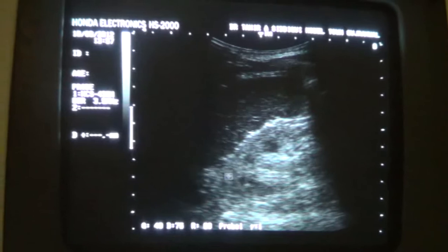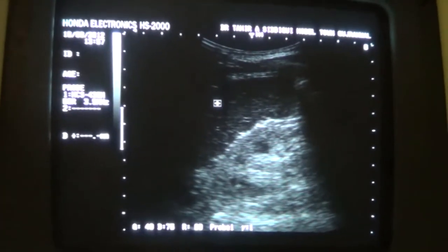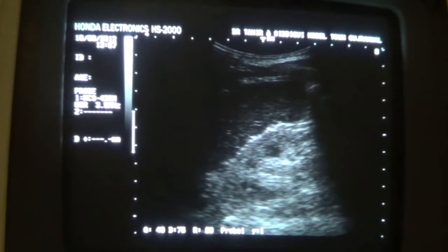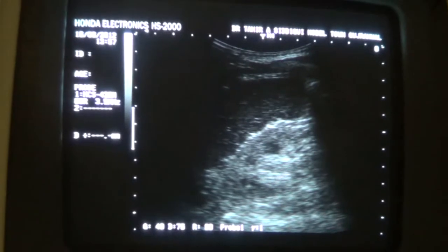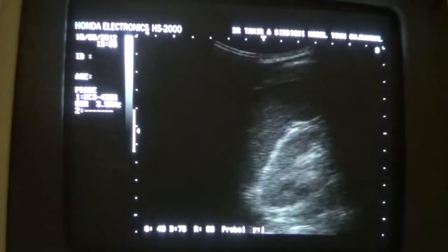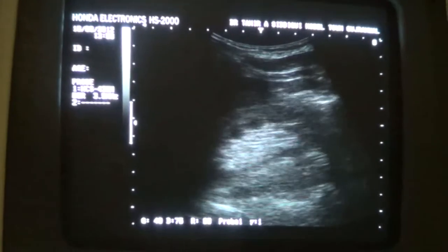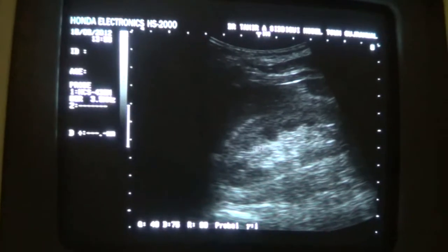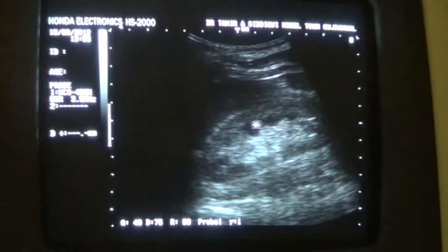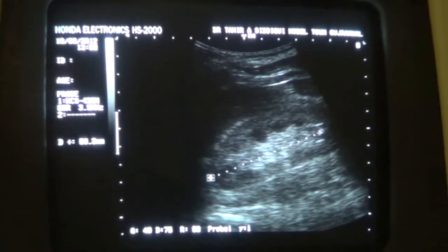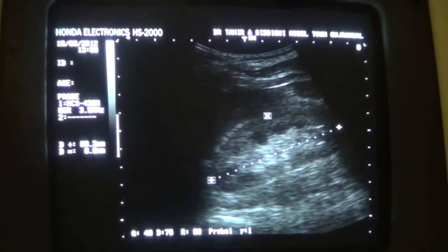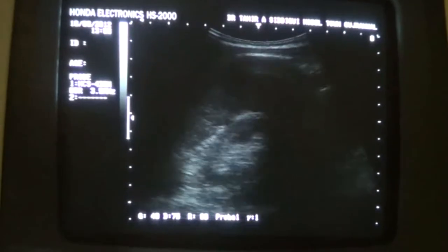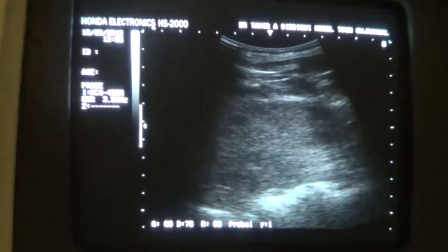Compare the echogenicity — this is the parenchyma, the cortex of the left kidney; this is the supra-renal parenchyma. Note the brightness difference at the upper pole — this is the upper pole of the left kidney. The central sinus echo complex is seen muffled, pyramids are somewhat prominent in this case, and the central sinus echo complex, though present, is in the right area with prominent renal pyramids in the medullary region. The kidney measures 8.0 cm in length and 3.2 cm in anterior-posterior diameter, which is a normal dimension. This kidney is within normal dimensions, showing grade 1 renal parenchymal changes.